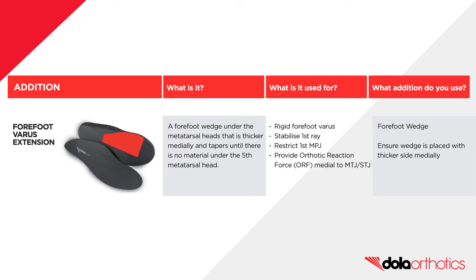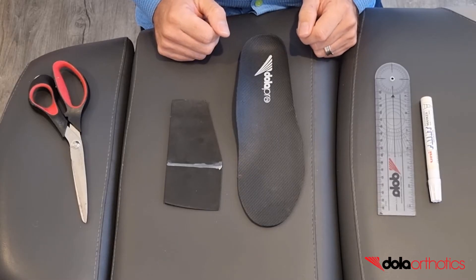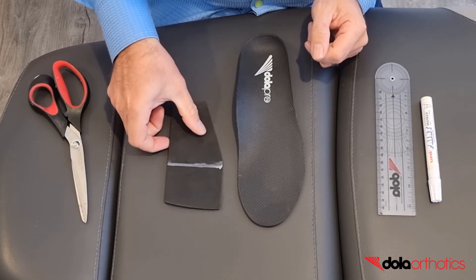This modification can be used for a rigid forefoot varus to stabilize the first ray, restrict first MPJ movement, or to provide a medial orthotic reaction force on the MTJ or STJ depending on joint axis. Customization of the Dola Pro with the addition of a forefoot varus extension.